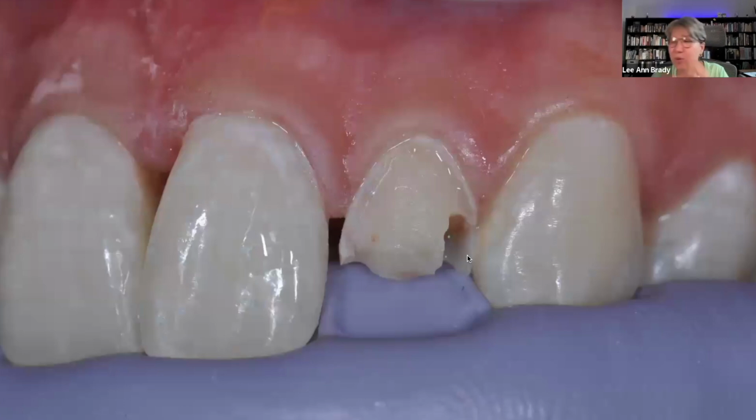And so, if we're thinking about doing that from a clinical perspective, this happens to be a young patient who had a car accident and went through a windshield, and we're trying to just get these teeth so she can go back to school. Why in this case did I actually almost veneer the labial of this tooth? Because that's definitely taking my concept of a long bevel and a blending zone pretty much as far as we can take it as a prep. I've actually done like a 3/10 of a millimeter, 5/10 of a millimeter veneer prep on the portion of the tooth that she did not fracture.